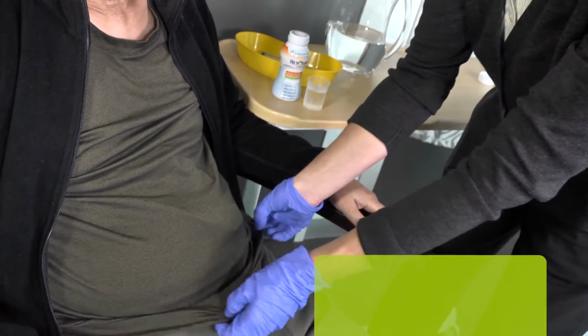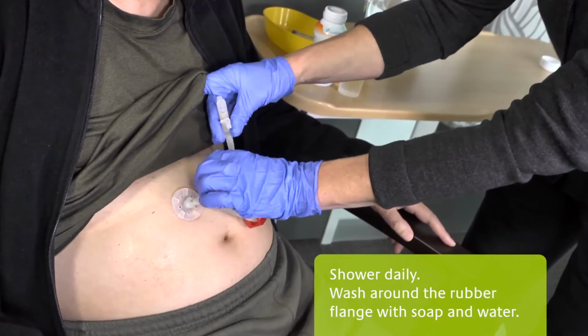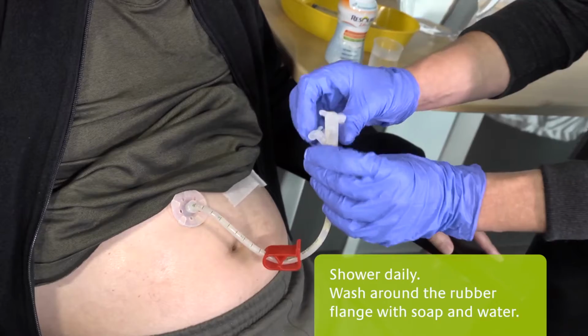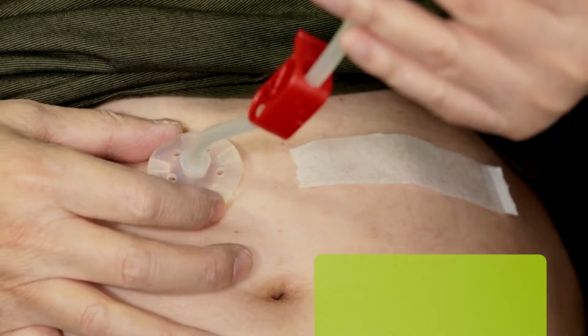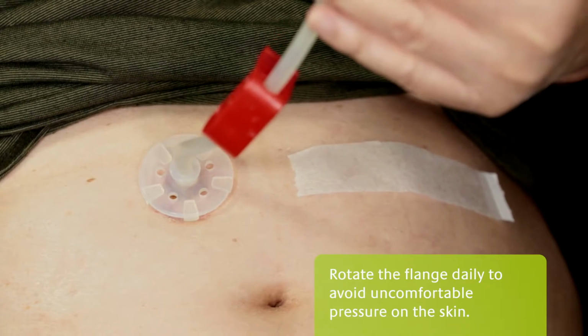It's important that your gastrostomy tube and the skin around your tube stay clean. Here's what you can do to keep it clean and functioning well. Make sure that you have a daily shower. Take care to wash with soap and water under the round, soft rubber flange. Rotate the rubber flange daily so that you don't put uncomfortable pressure on your skin.